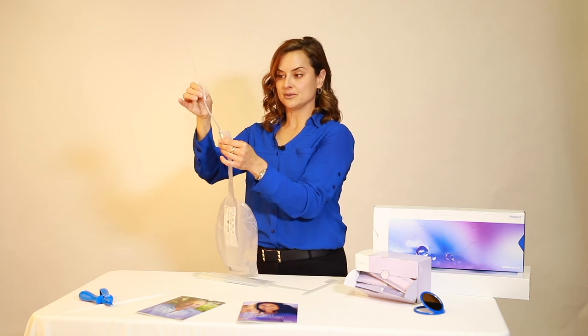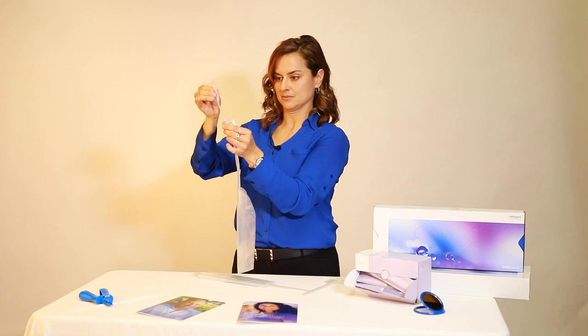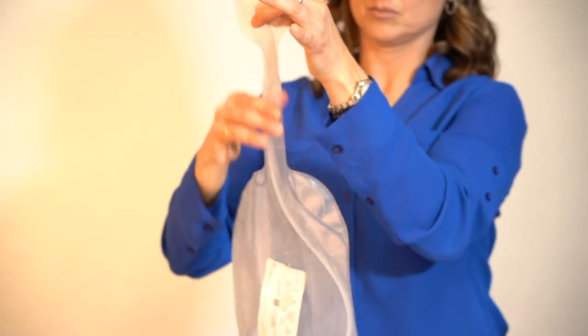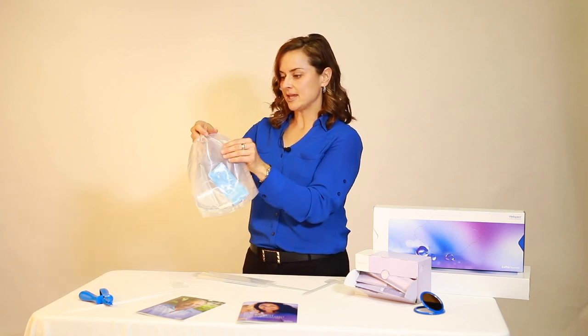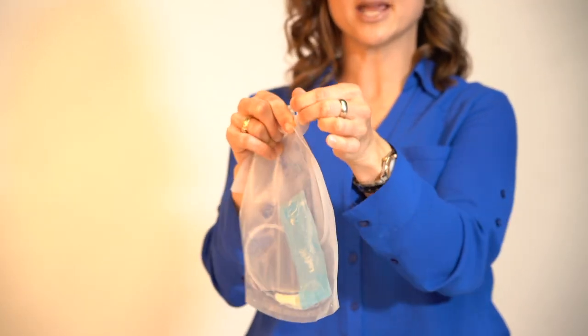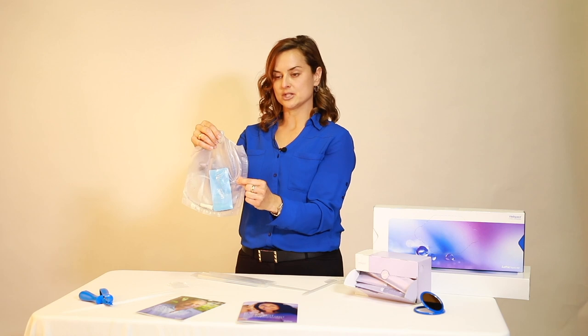After using the catheter, the end-user can push the catheter back into the bag, tie the Lofric HydroKit bag, and then discard at a convenient time. There is a little spout on the side so that when the end-user is in a restroom, they can simply tear this piece of plastic off and then empty the urine into the toilet.